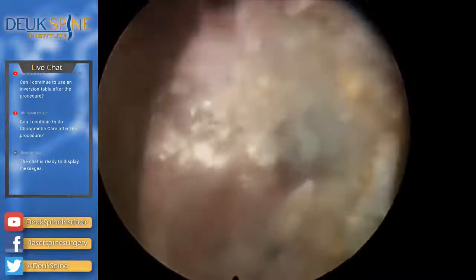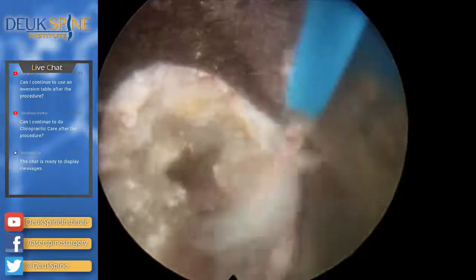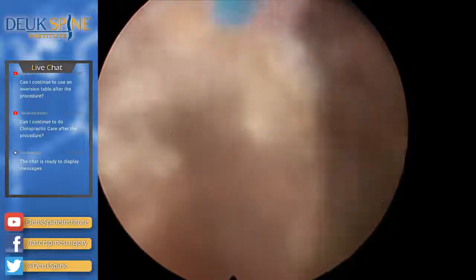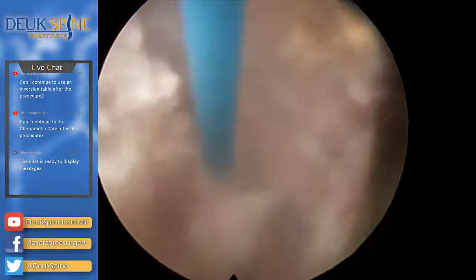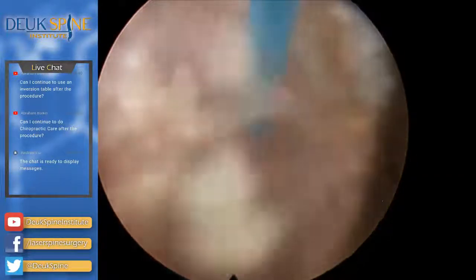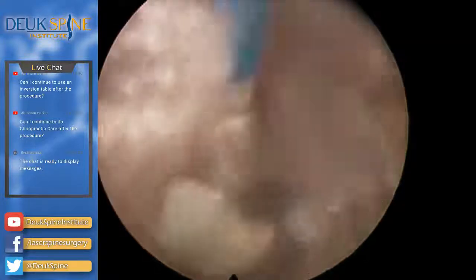We are at the L5S1 disc, and you can clearly see back here there's a tear. There's really not a lot of disc left at all. It's almost bone on bone, but there are some bone spurs here that I'm getting rid of with the laser right there. That's a bone spur, and it's right where the nerve is, just underneath it. There's some old chunky herniation, which we'll grab with the grabber because it's not going to float out. More bone spurs.